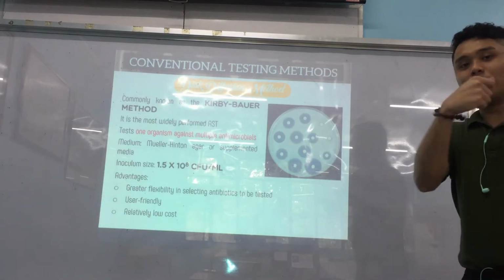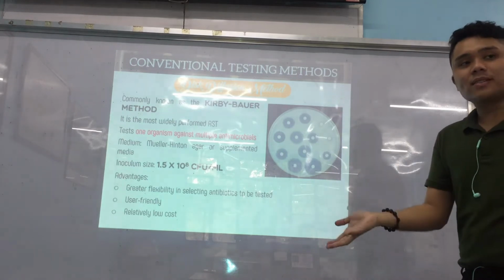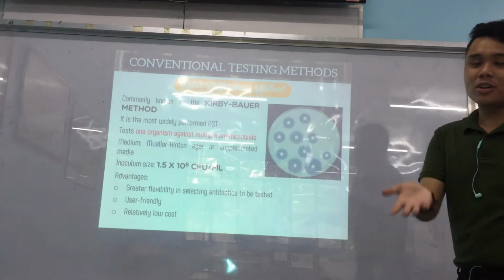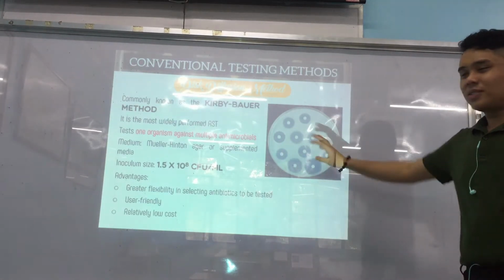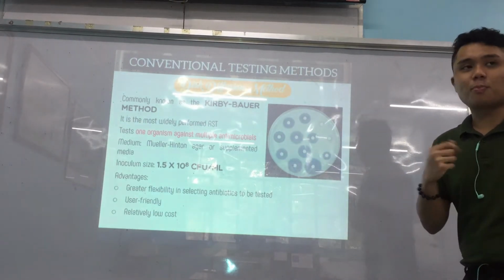You just perform the inoculation, overlap the lawn, and then we place the discs, and then incubate. And after incubation, we examine. So it's not that demanding in terms of expertise or performance.